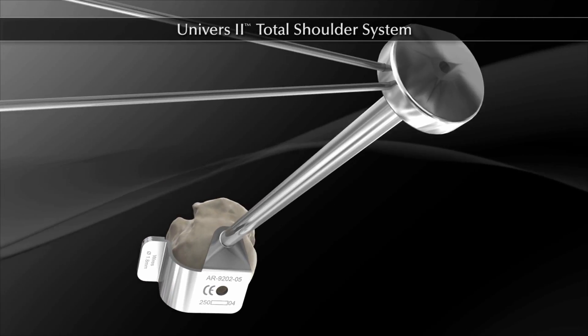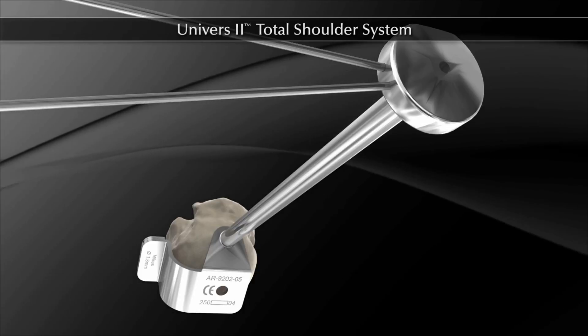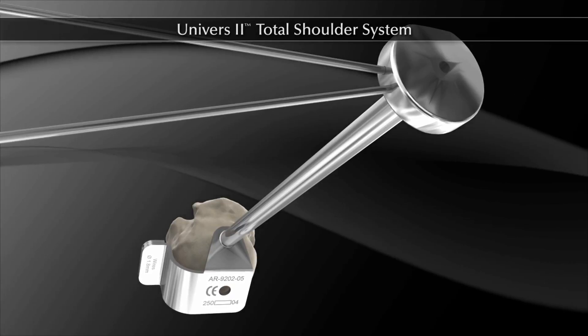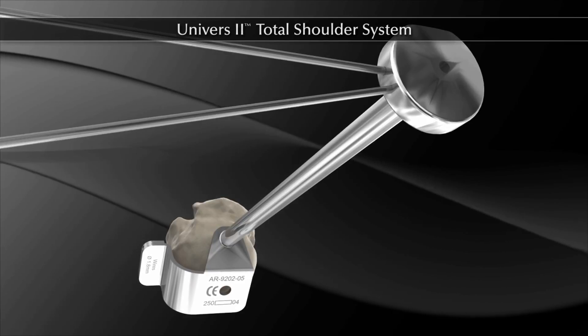When the guide is used, the appropriate head resection guide — right or left, large or small — is placed on the humeral head. One or two version rods are placed in the guide and aligned with the flexed elbow to determine appropriate retroversion.